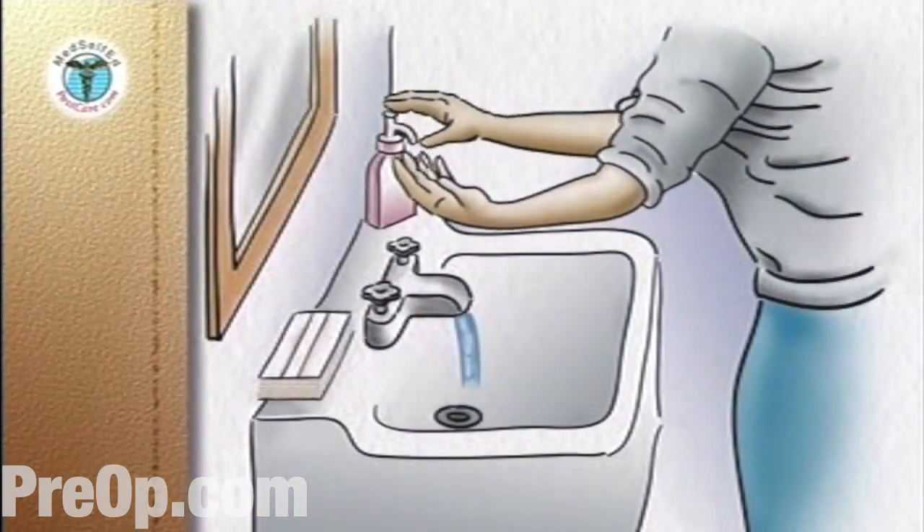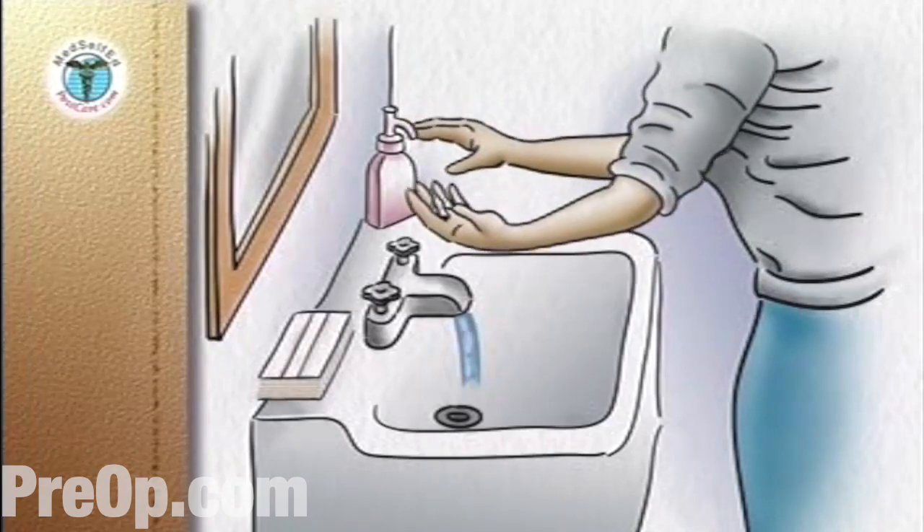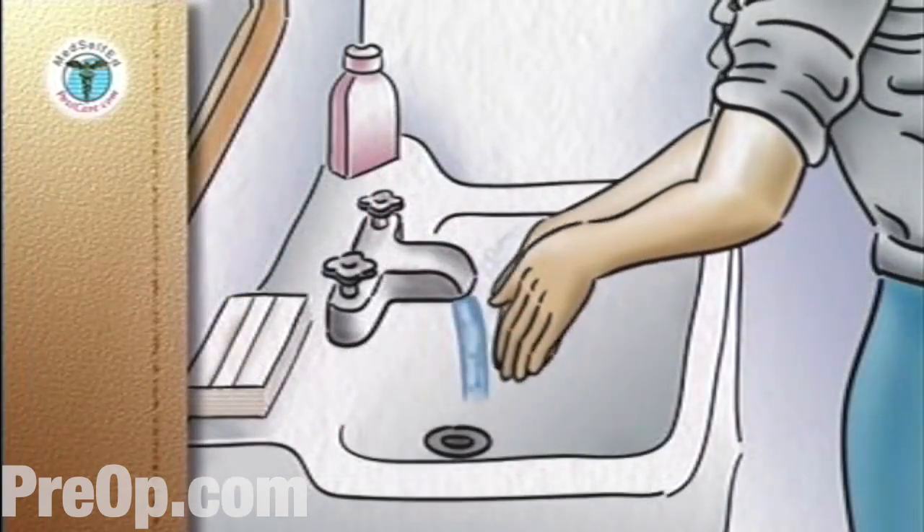Wash your hands vigorously with soap and warm water. Rinse and dry thoroughly with a paper towel.